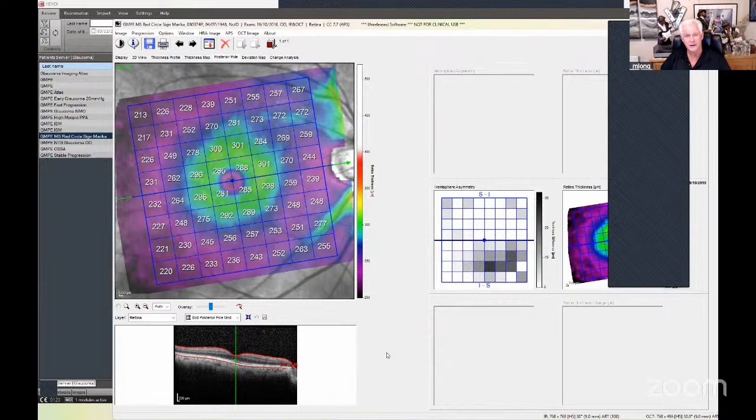Is the patient highly myopic and may naturally have a thin retina, but they have to be like -8, -9, something like that to have an effect of a really purple thin retina like that on your OCT? Or have they had some vascular occlusion that might have caused a thin retina? Or have they had an event of optic neuritis that may have caused a thin retina? So you go through a process of elimination in your mind.